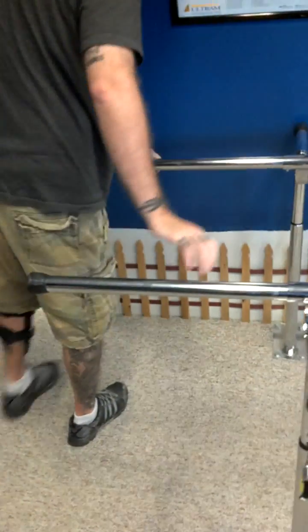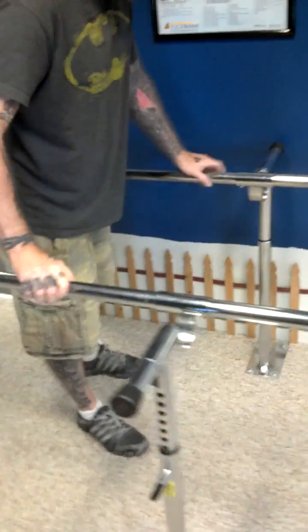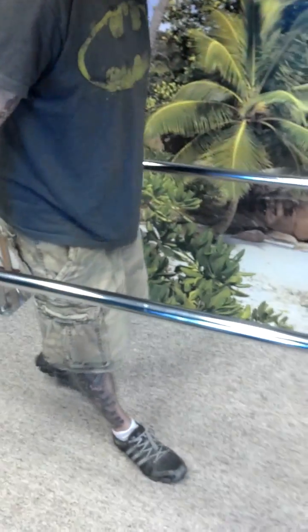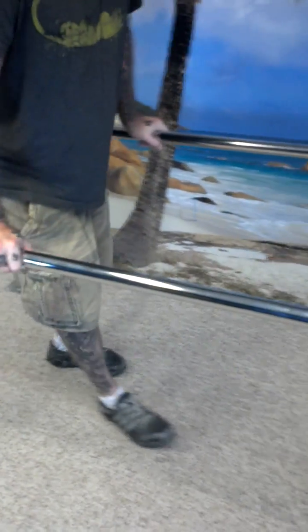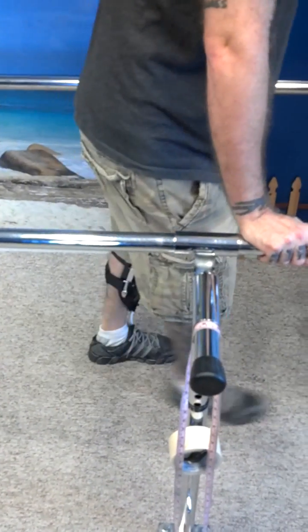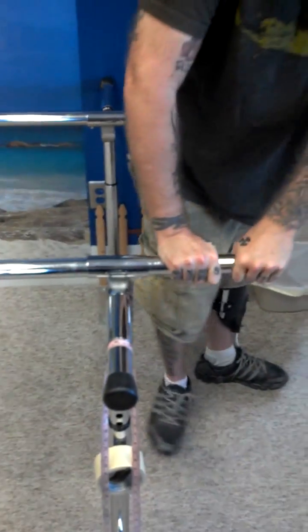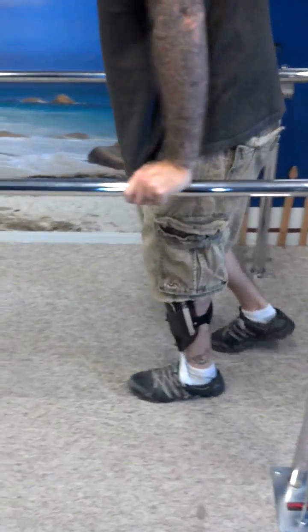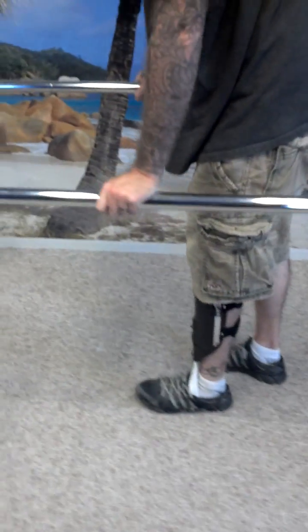Let's go up and down a couple times here. You're definitely having a lot better clearance — that leg's definitely coming in front of you better. Yeah, I don't feel my heel dragging or my toes dragging. That's actually really nice. It's got that spring in there.